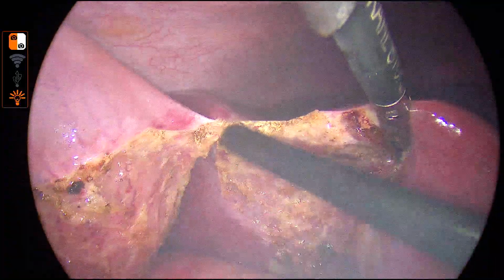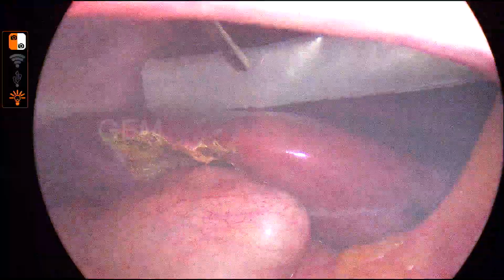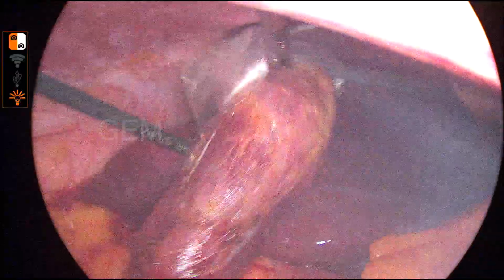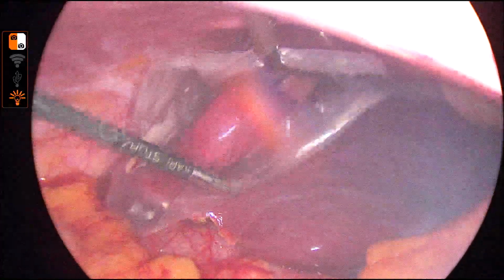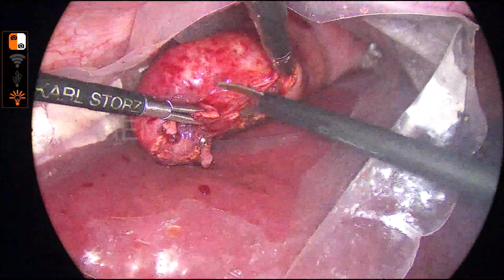So the gallbladder separation is completed. Now another task is there, retrieval of this gallbladder. It is a distended, thick-walled gallbladder, and usually it has a big stone at the infundibulum or infundibulocystic junction. So how to retrieve? The best thing, since this is an infected one, is to place it into the endobag. Because of this habit, we keep even the regular gallbladder in an endobag and then take it out.